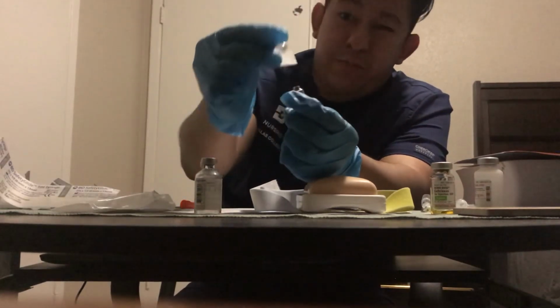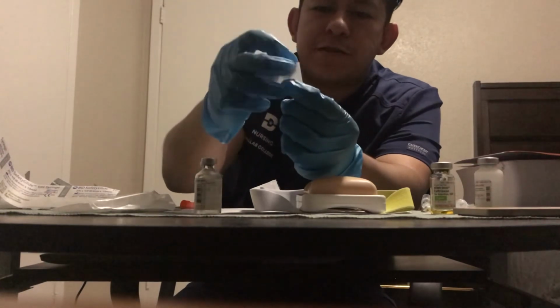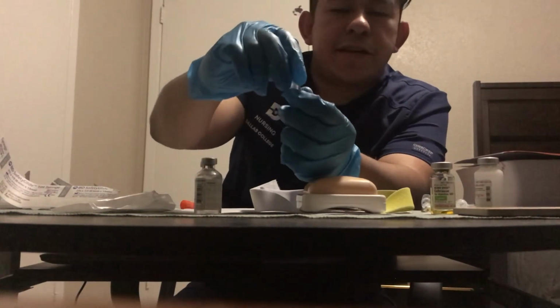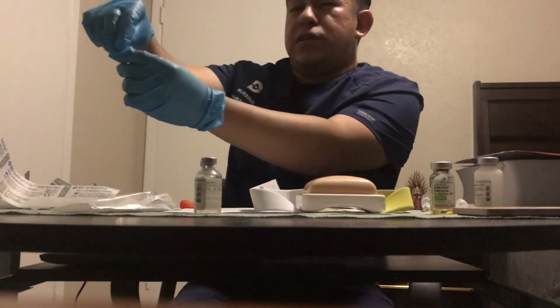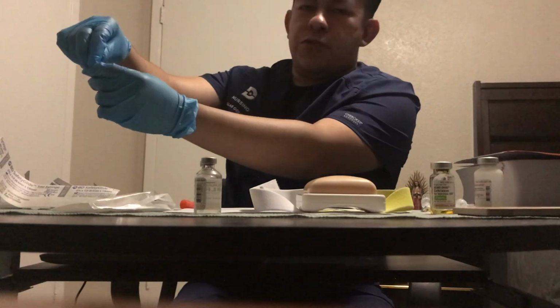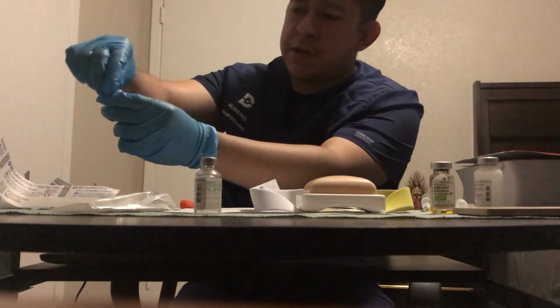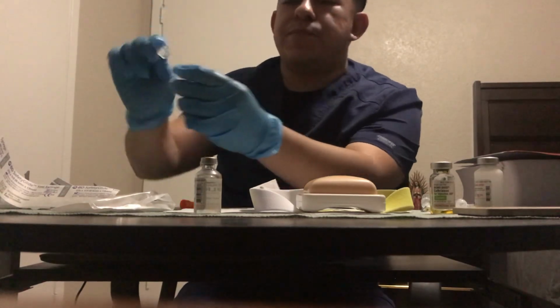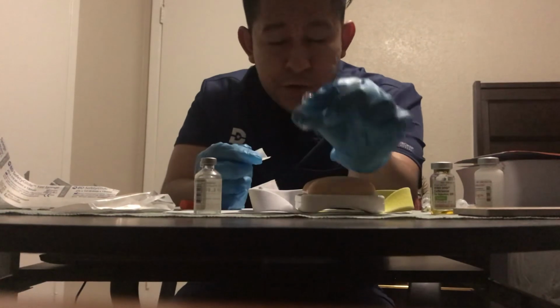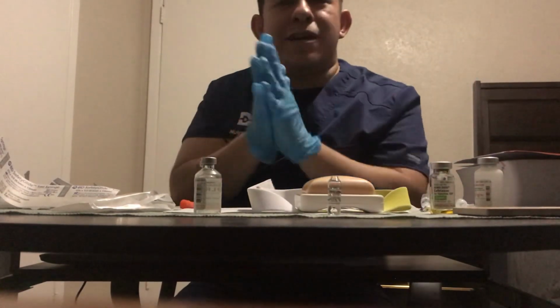There's a glass tip right here, and there's a line etched at the neck of it. So you wrap your alcohol pad around the neck, and you snap it in half, but do this away from you, from the patient, from anybody else, so you don't get glass in their eye or anything. And you simply dispose of this in the sharps, and you would draw this up using a filtered needle. But yeah, that's about it.